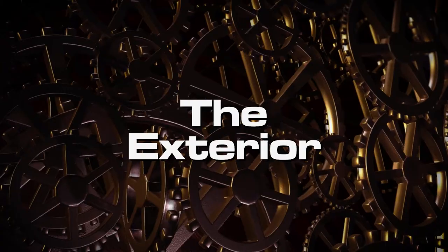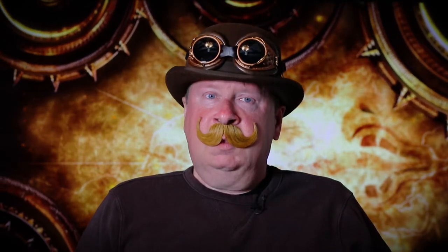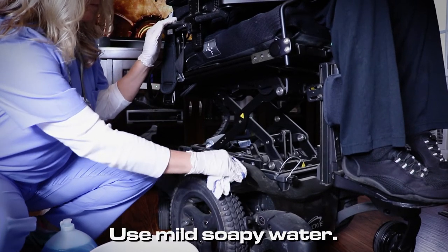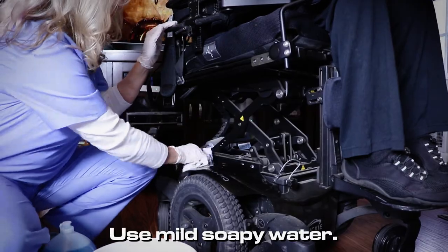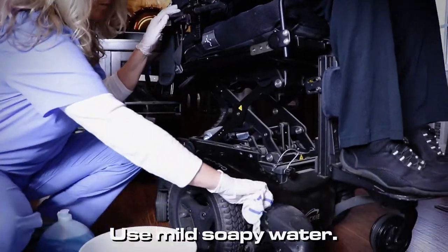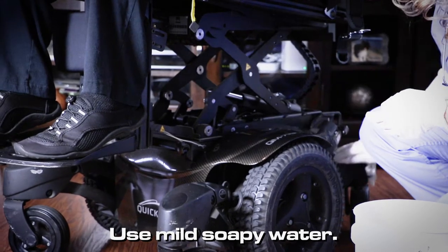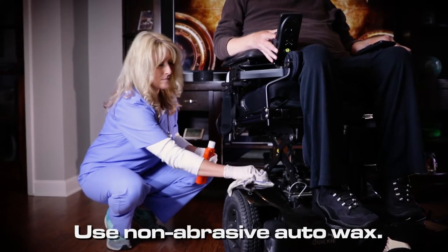First, the easy stuff — the exterior. It's very technical. Once a month with mild soapy water, wipe down the shroud and outside components. And if you really want it to shine, every three months or so, use non-abrasive auto wax.